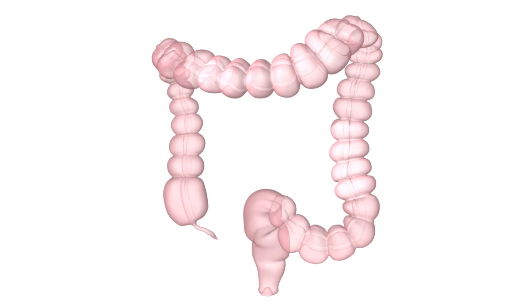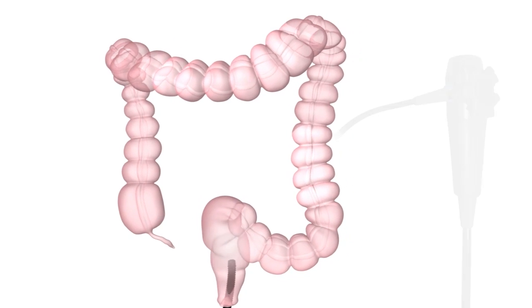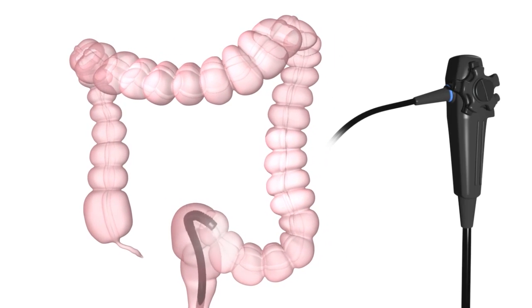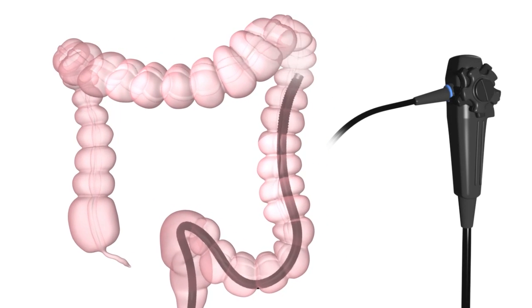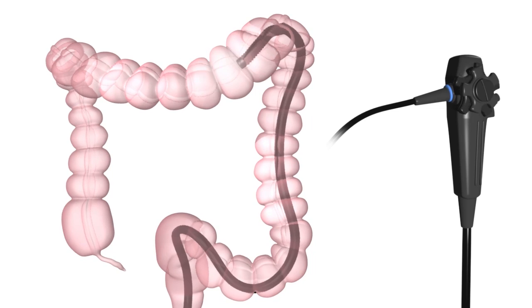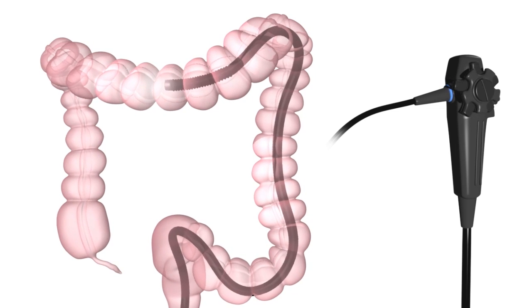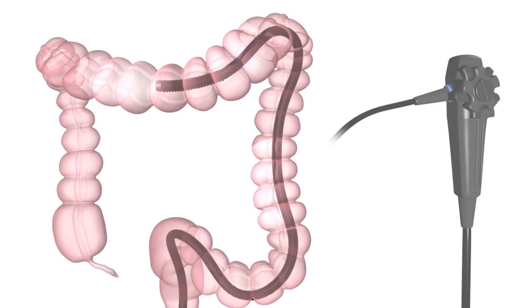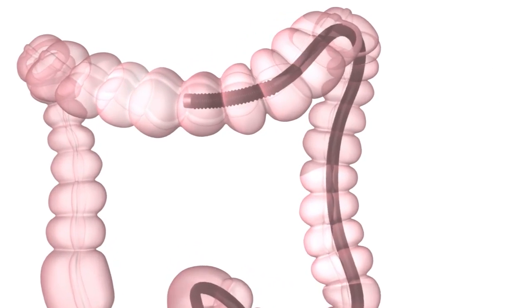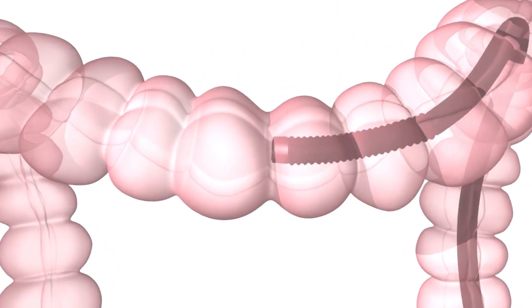A colonoscopy is performed using a colonoscope, a flexible tube that is inserted through the anus and guided through the colon to the cecum. A small amount of air may be blown into the colon to help with the visualization.